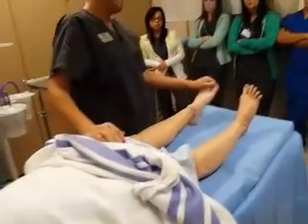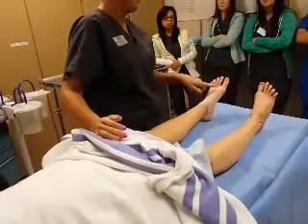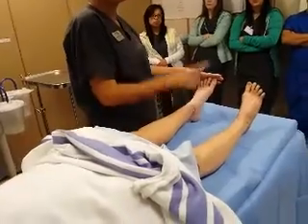If you're doing a bunionectomy or a hammer toe, where do you think you would prep? Ankle to toe. All the way to the ankle. Ankle to toe. Can I ask what a hammer toe is? The toe looks like that.